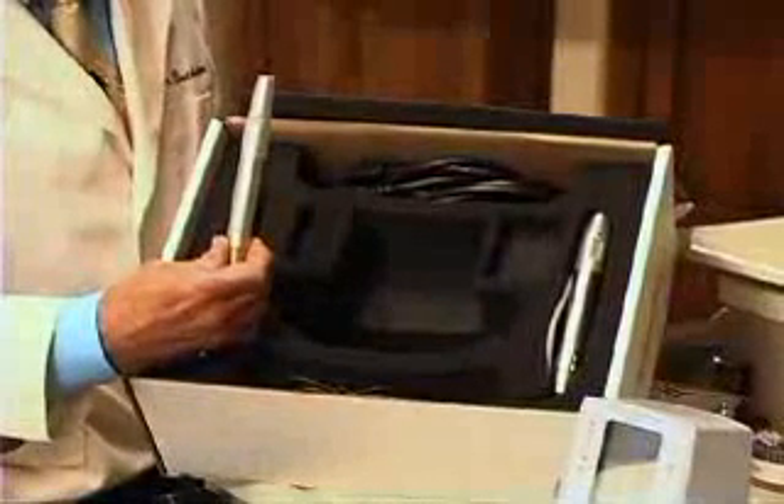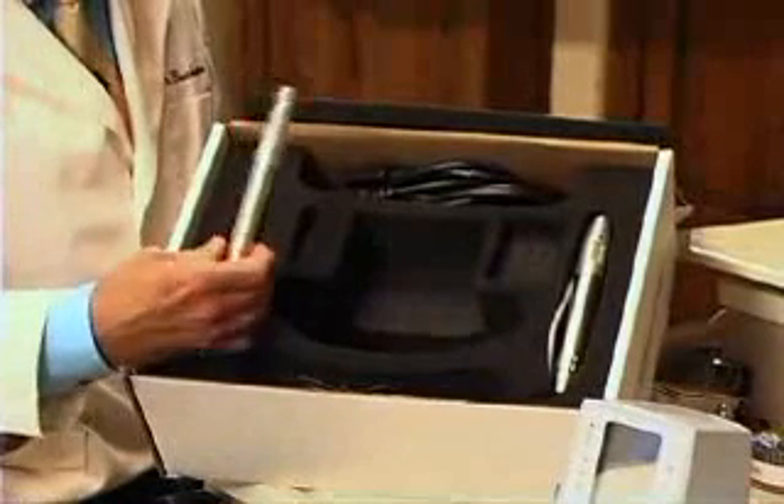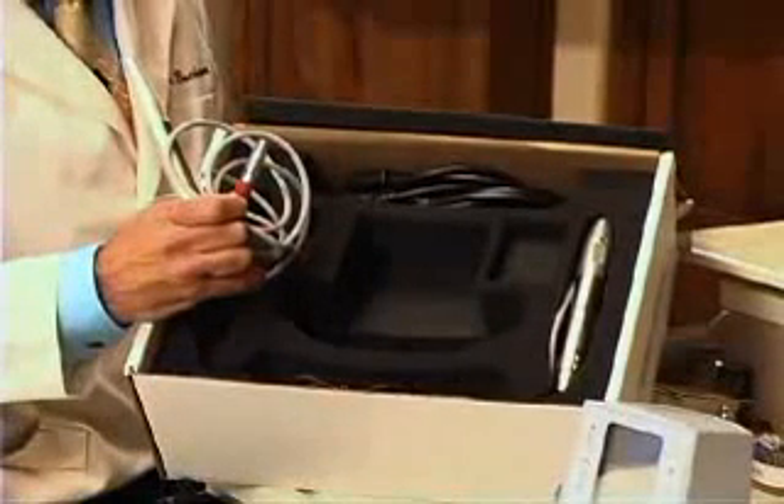This is the new System B handpiece. It's really nice. It's got a silicone cover and an easily pushed button with a light on it. The cord has a medical grade plug that can stand up to any kind of abuse in the clinical environment.